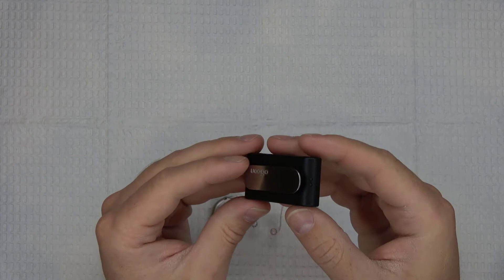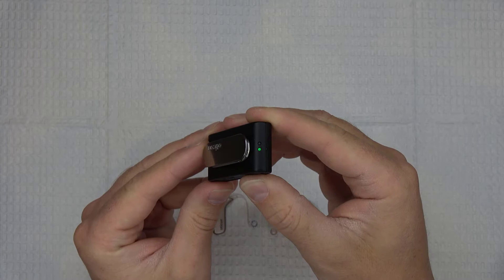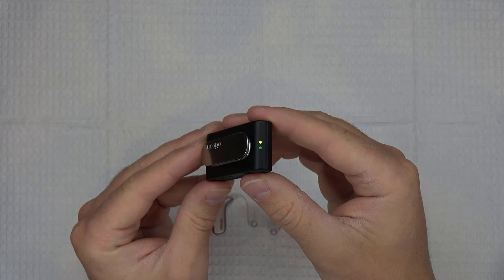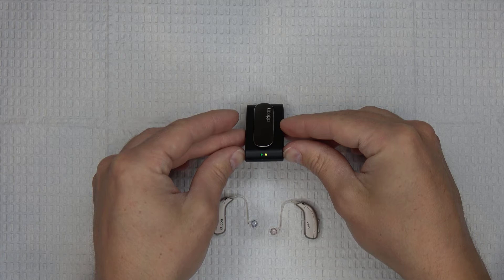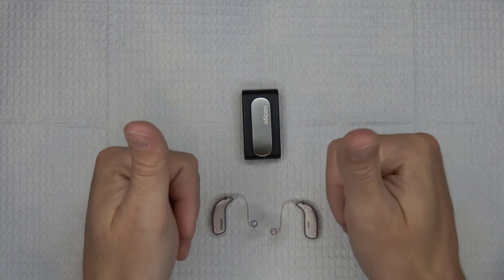Next, turn the Connect Clip on by pressing and holding the multi-button for about 3 seconds. You'll start to see the indicator light on the Connect Clip turn on and show solid green. You'll then see a blinking yellow indicator light symbolizing that the Connect Clip is searching for hearing aids. Place your hearing aids and Connect Clip close together for this step, making sure that they are both within 8 inches or so of each other. The Connect Clip will eventually switch from a blinking yellow light to a solid yellow light when it establishes a successful connection to your devices.